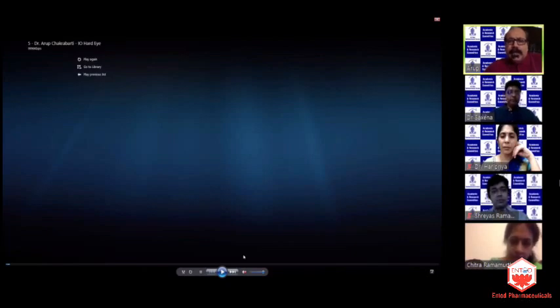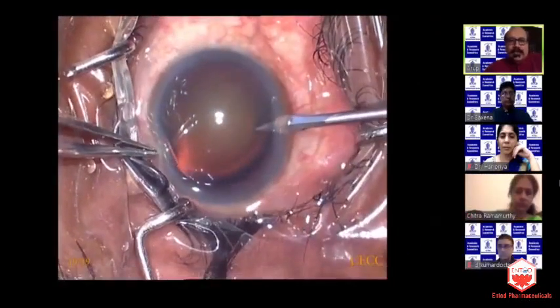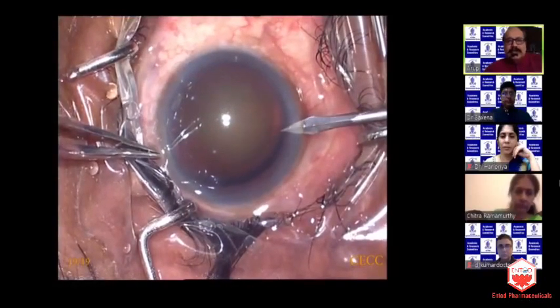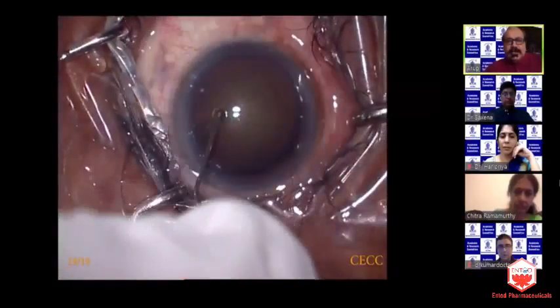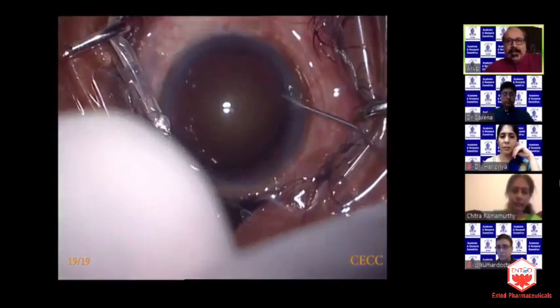So I decided, can I have the video on now? So I decided to go ahead with routine cataract surgery for her under topical anesthesia. As you see me making the paracentesis incisions, both superiorly as well as inferiorly, the anterior chamber is shallow. The MVR tip impinges on the anterior capsule. I was careful, so I did not have any damage to the anterior capsule.